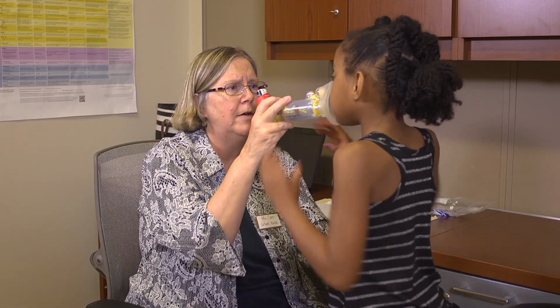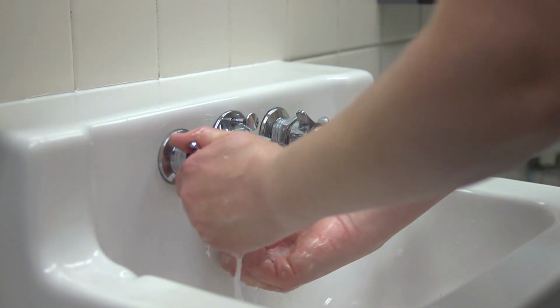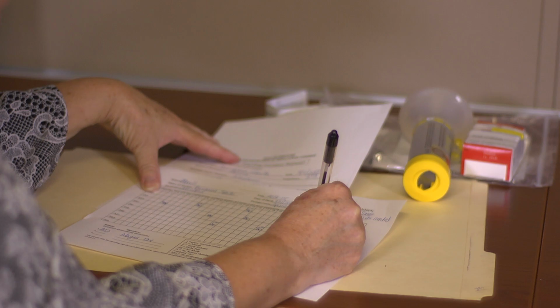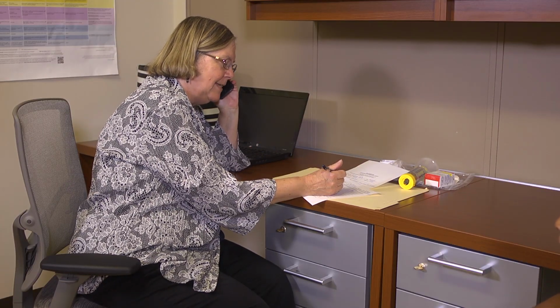The procedure is slightly different for the child using a mouthpiece and spacer, or if the child is not using a spacer at all. Check with your school nurse for specific instructions. Have student rinse out their mouth with water and spit as needed. Wash hands. Document medication administration in student's medication administration log. Follow up as needed with parents or guardian and healthcare provider.